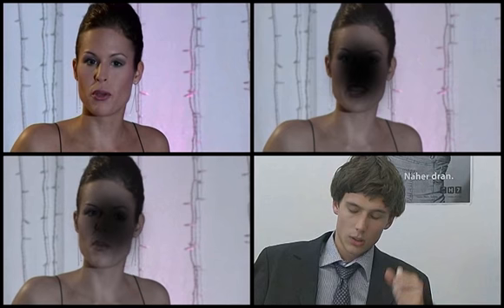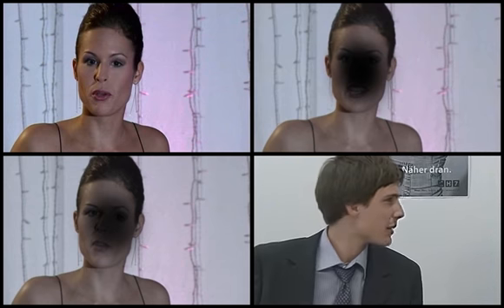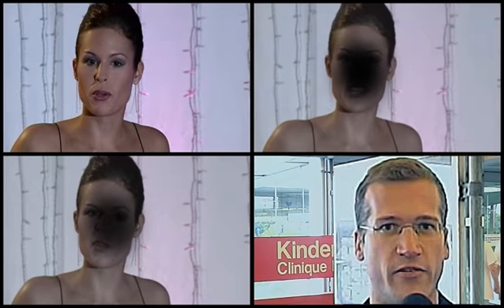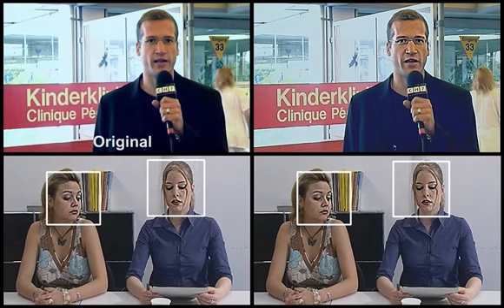Patients with central vision loss, such as AMD patients, often have difficulties in recognizing faces and facial expressions in movies, and have therefore trouble following the storyline. They rely on peripheral vision for identifying faces. We present two real-time video enhancement techniques to overcome this problem: blended filtering and constrained scaling. Both can be combined in order to compensate for reduced contrast sensitivity, decreased visual acuity, and a scotoma in central vision. AMD subjects have reduced contrast vision.